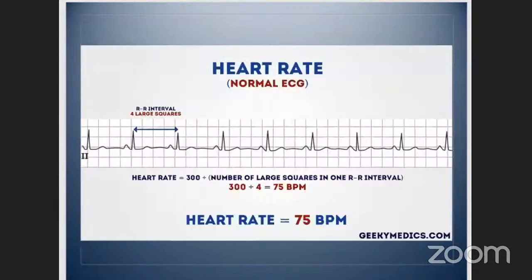And so we said rate. To determine our rate, there are several different ways that we can use. Most of us would be familiar with this method, using the space between our QRS complexes or ventricular beats, so the distance between beats. You find a QRS beat that largely falls onto one of the lines within the ECG, then count the blocks between that and the next beat, and divide 300 by the number of blocks to get our heart rate.